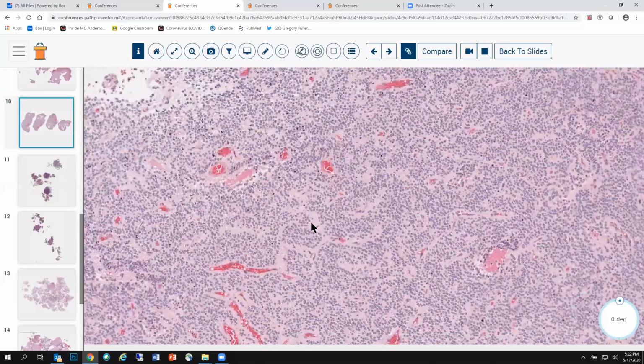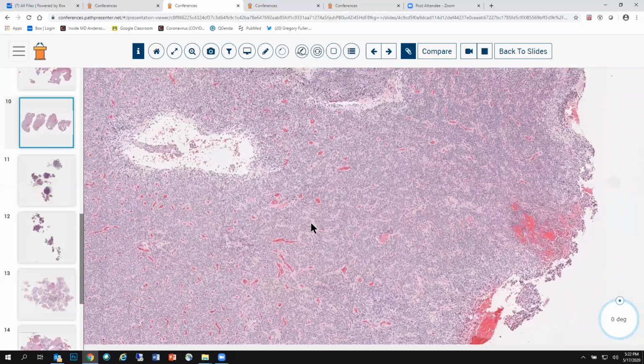That is another clue. It was actually mean to have all of these cases with no clinical history, but you know what? It helps you to develop an eye for the very fine details of the different tumors. And I tell you, it's so important to point out the importance of the pre-op imaging. If this case even seemed challenging to you in the least bit, it's because you did not have the pre-op imaging. If you had known that this was a significantly sized mass in the lateral ventricle at the foramen of Monro, extending into the third ventricle, obstructing the foramen of Monro, causing obstructive hydrocephalus, the first 10 things on your differential would have been central neurocytoma. Pre-op imaging, absolutely critical.